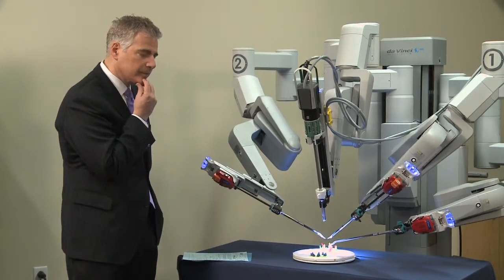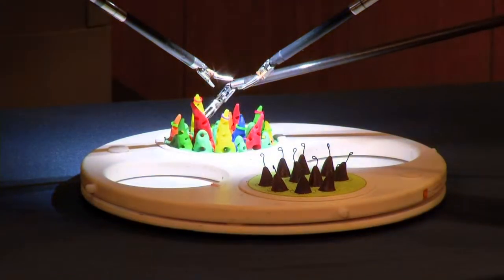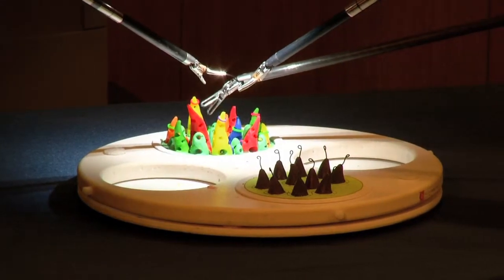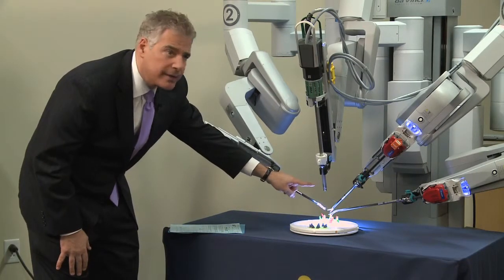So, Steve, I have control of 4 arms, and 3 of the 4 arms have instruments, and one of these has a clutch. So I'm always in control of 2 of the 3, as you can see. In addition, I have control of the camera, which allows me to move in and out from the surgical field. The camera's right here, right, team?